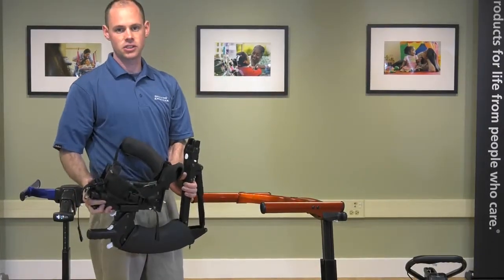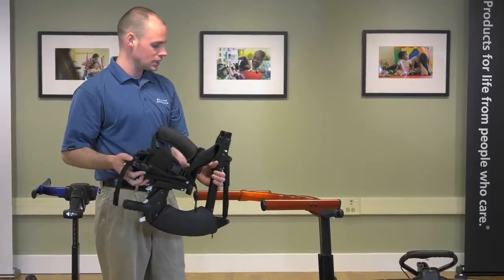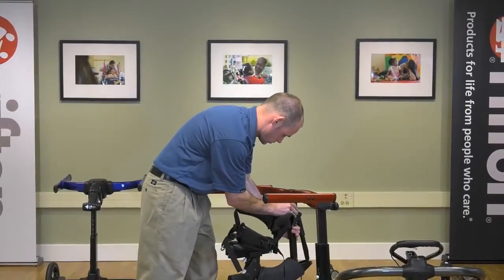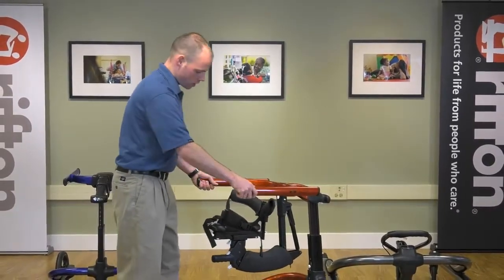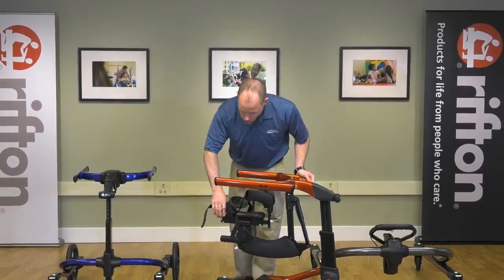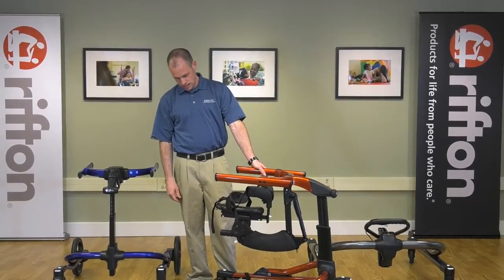Obviously, that's a safety feature, so that if someone hits a button while someone is in the pacer, the MPS does not fall out with someone still in. So that's how it's installed. I will move on to the different positions and adjustments that you can make on your multi-position saddle.